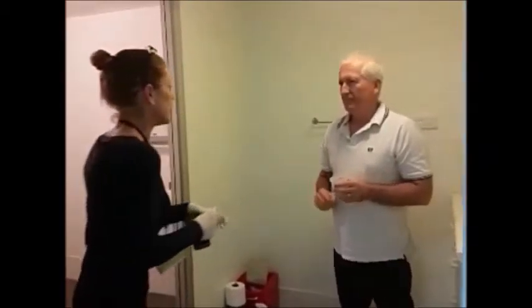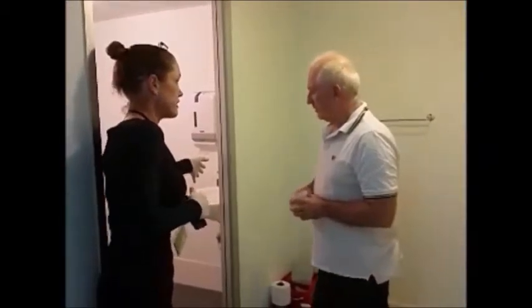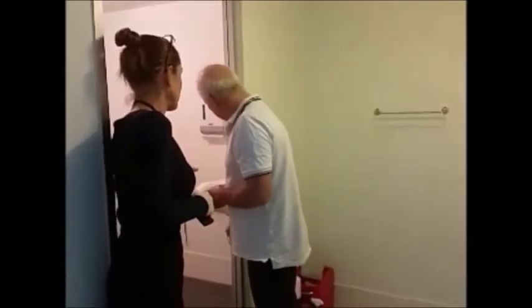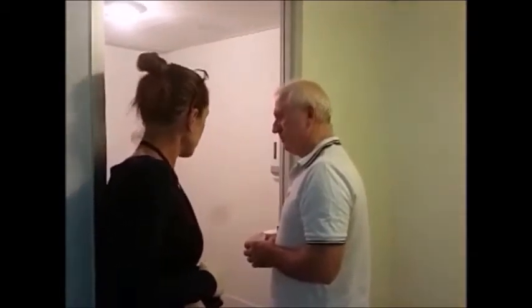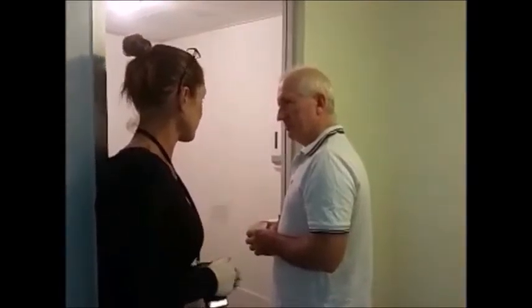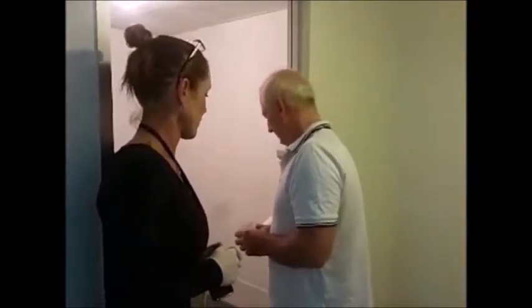Wonderful, thank you. Okay, so obviously I've sealed off the taps in here, so there's no water access. I've also popped the blue in the toilet. You can close the door, but please don't flush the toilet. Okay, go for it. Thank you. Just pass the cup back to me as soon as you're finished.